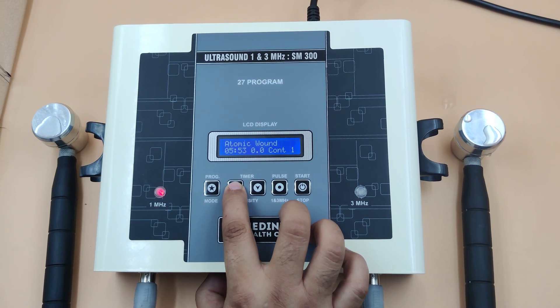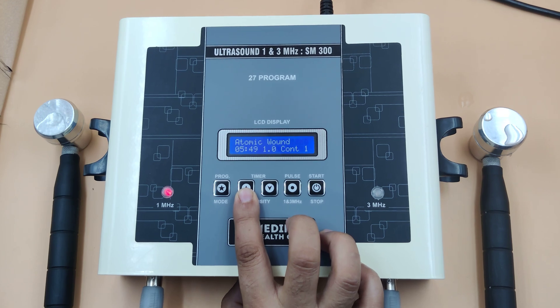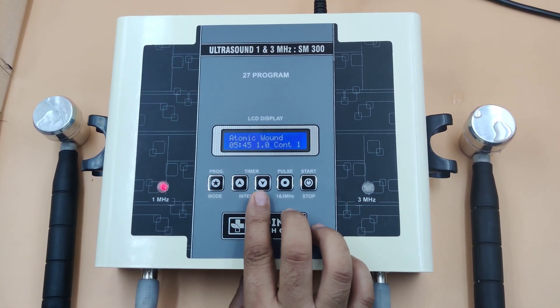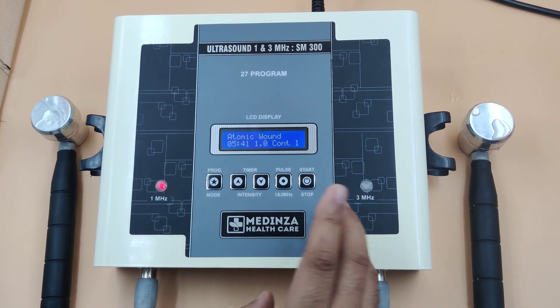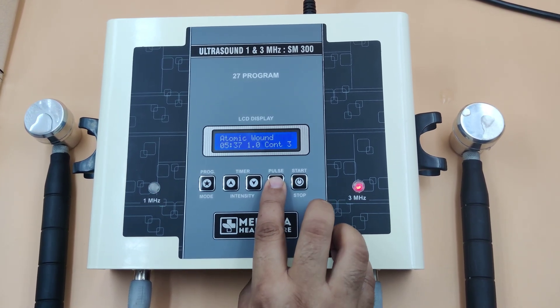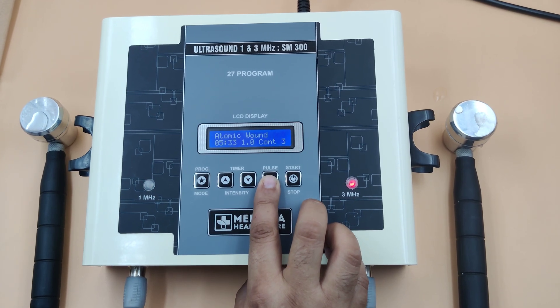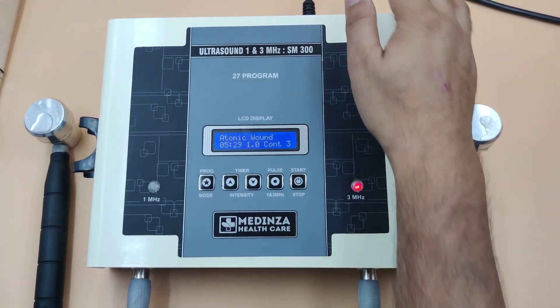Increase the intensity as per your need. You can shift the current from 1 megahertz to 3 megahertz by pressing this button — 1 megahertz, 3 megahertz, 1 megahertz, 3 megahertz. After the treatment is completed, switch off the machine.